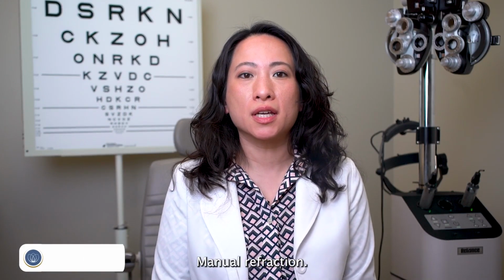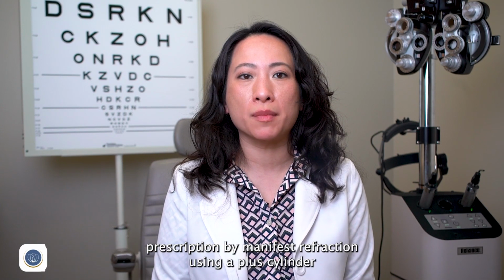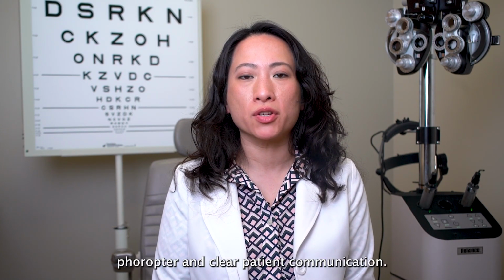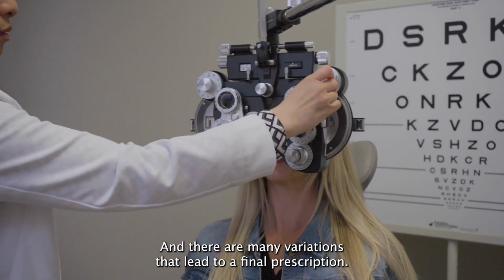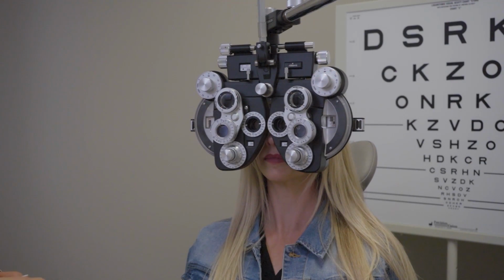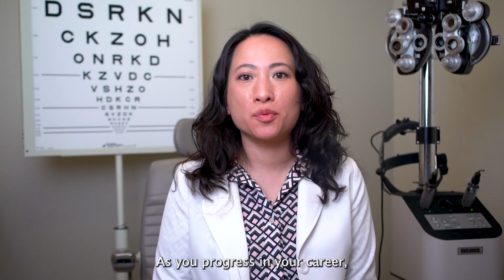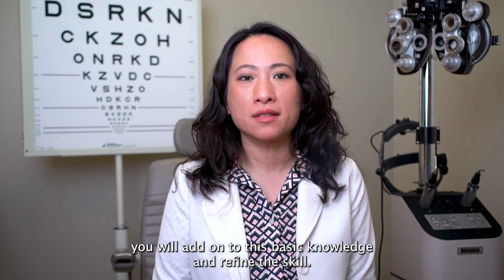Manual refraction. In this session, you will learn how to determine a spectacle prescription by manifest refraction using a plus cylinder phoropter and clear patient communication. Refraction is a bit of an art, and there are many variations that lead to a final prescription. You will learn the basics of refraction in this session. As you progress in your career, you will add on to this basic knowledge and refine this skill.